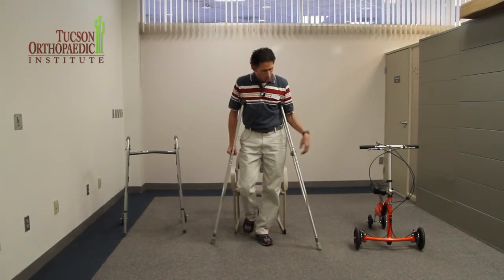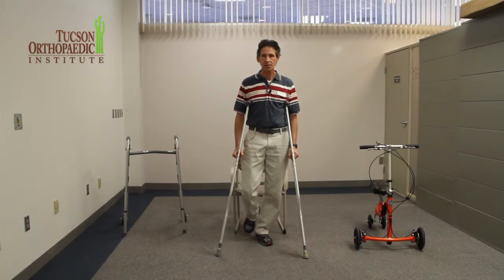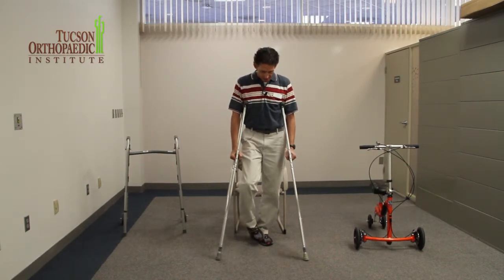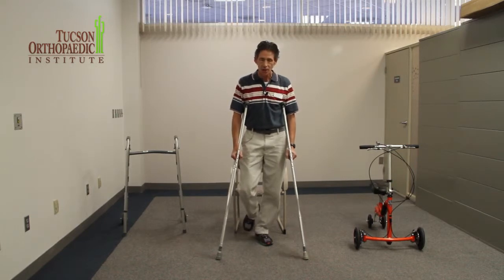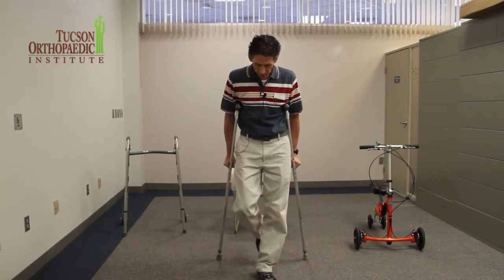Now when I want to walk with the crutches, the important thing is to maintain stability. So the important thing is to have the crutches out in front of you a little bit, and then the leg that you're able to stand on behind you. Then I'm going to take a step, push through, and then my left leg comes through.